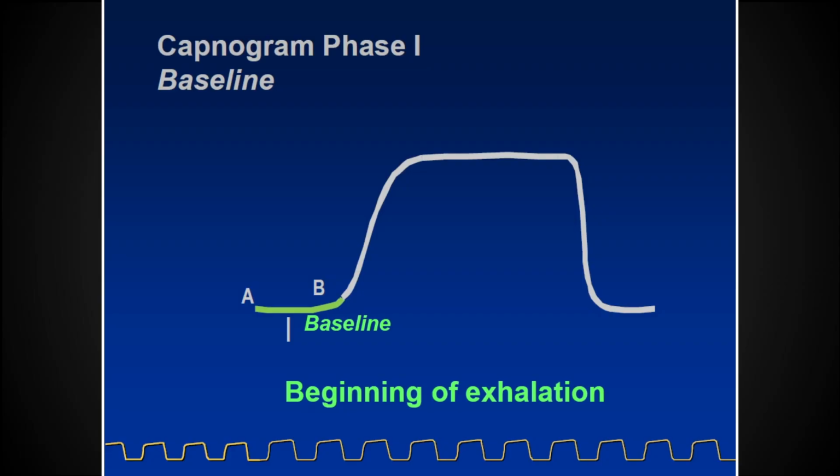Normal end tidal waveform. The reason I bring this up is, even though I generally explain to people, like these glove boxes stood up, that end tidal waveforms are kind of just rectangles marching along, many times people will see this slight curve here and be like, oh, that's bronchospasm, that's a shark fin. And I'm like, no, the expiratory wave here takes a little longer. It always takes a little longer to get the air out than in, right?